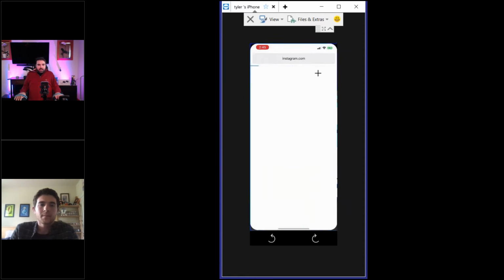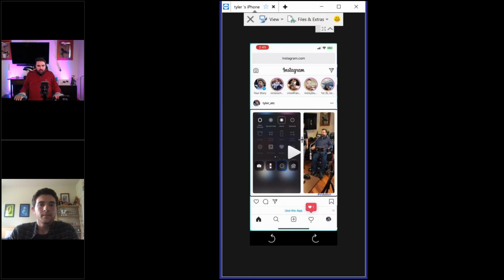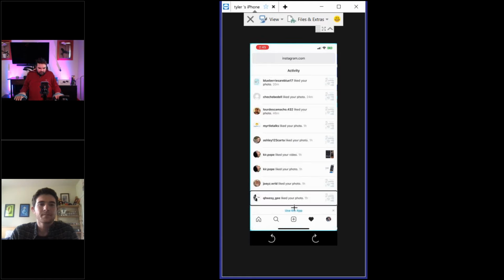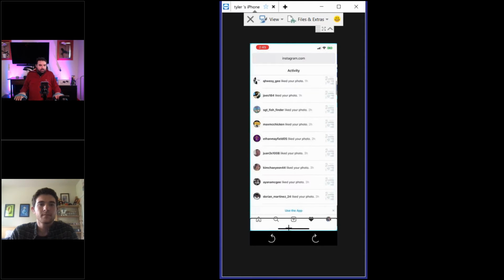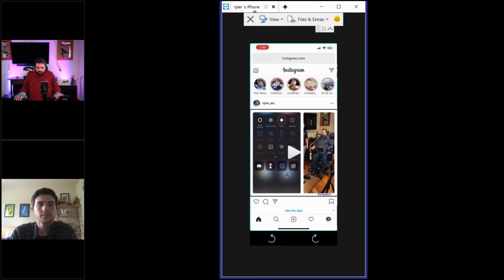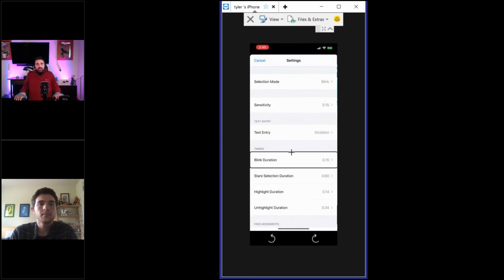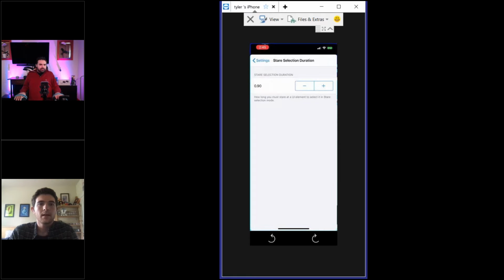Cool. Yeah, super easy. Just scrolling along. Blink. Scroll, go back, and go home. So when I was playing around with this, it seemed like when I did stare, that was the one that I had to do the most modifications with. Is that normal or was that just me?